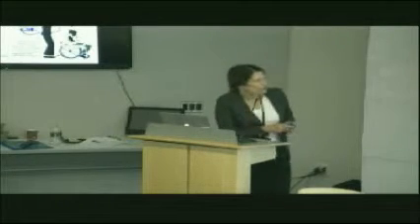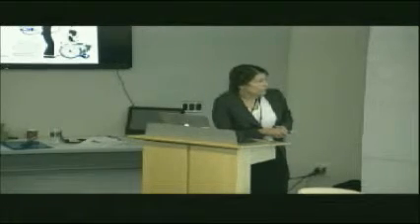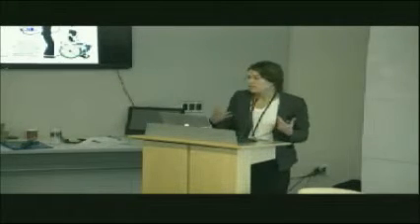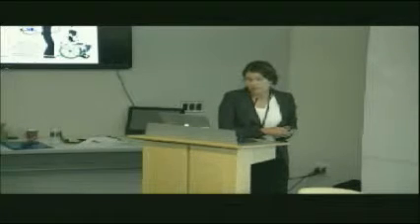And what I'm going to show you here is time on the x-axis. So baseline measure, everyone's at 0. Everyone was normalized, okay? Week 2, week 4, and week 6. This is how much that MEP changed, so not the size, but the improvement of that MEP size. And what you see is that 2 lines go up consistently. This is the biceps, and this is the wrist extensors. And they improved specifically on this special kind of therapy, this robotic therapy, which I'm being kind of vague about because I'm not sure that's the message. The message is that there was improvement with rehabilitation and in specific muscles.